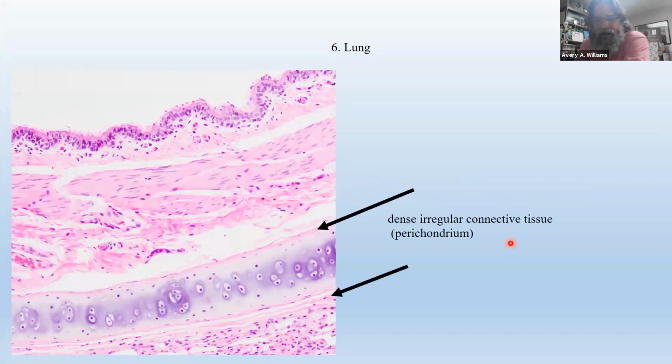And again, remember, still a lung slide. Beautiful picture right here of the hyaline cartilage that's in there supporting the bronchial. Here's the inside of a bronchial. But remember I said all cartilage, doesn't matter what kind it is, it's always going to be wrapped in perichondrium. So you can see right there at the edge, this is a different tissue. It's thin, but it's not cartilage. And right here, that's dense irregular connective tissue forming the perichondrium. So you always have perichondrium there.